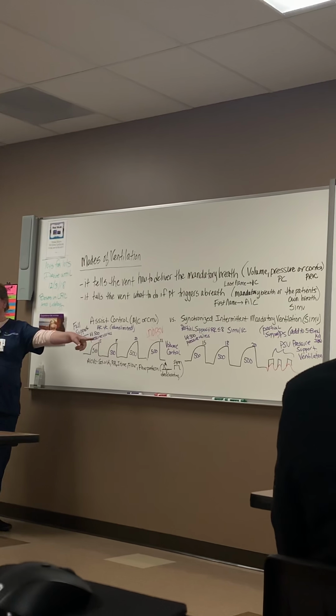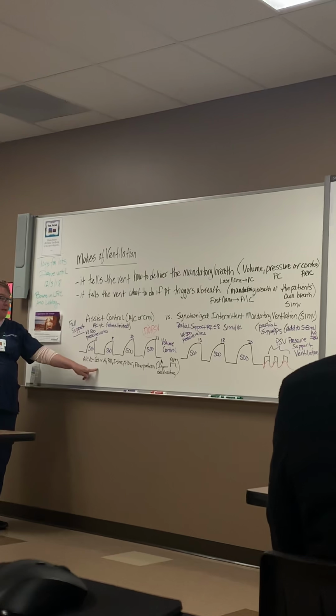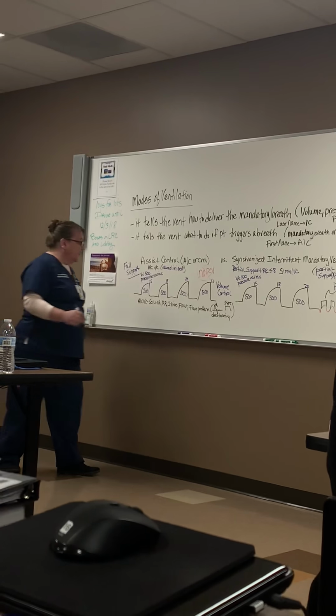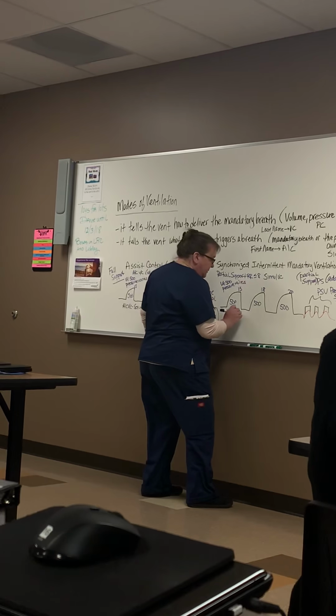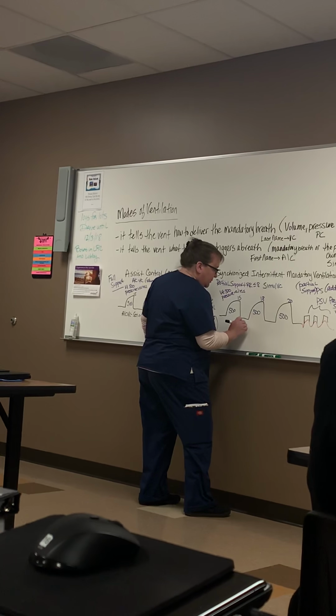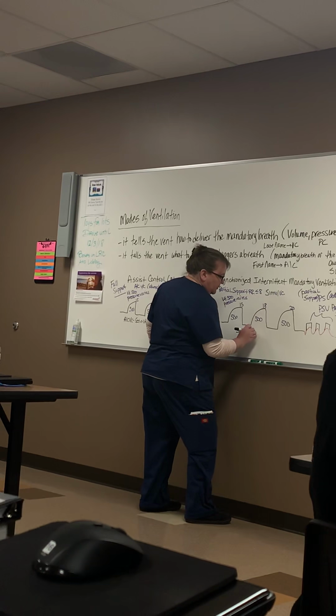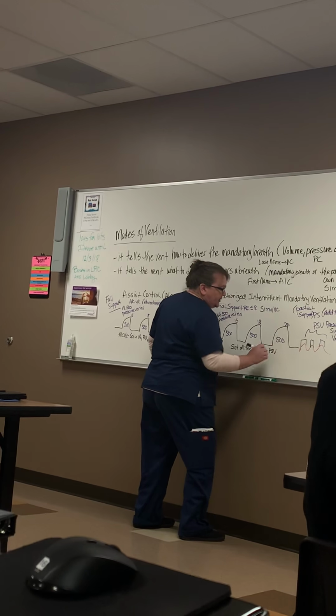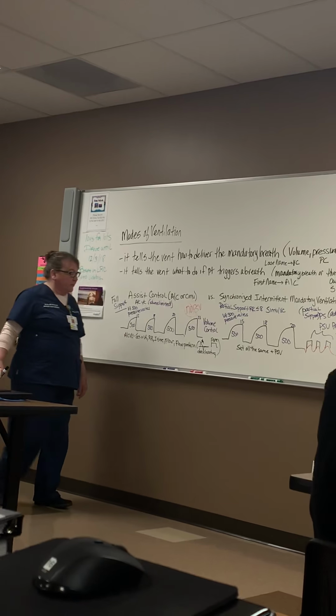In SIMV and VC, I can set all the same things. What am I going to add? Pressure support, yep. So all the same things plus pressure support on that side.